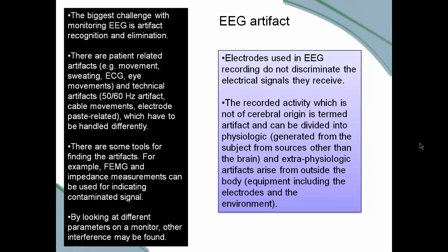People doing research in this area don't take that into consideration, and then they'll see some artifact, probably artifact, because they haven't taken the necessary steps to recognize and filter out confounding artifacts. And they'll say, oh boy, look at that, we've got some significant results, and they don't.